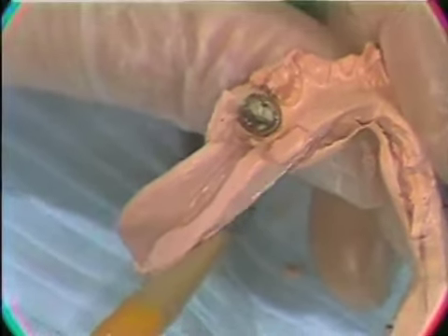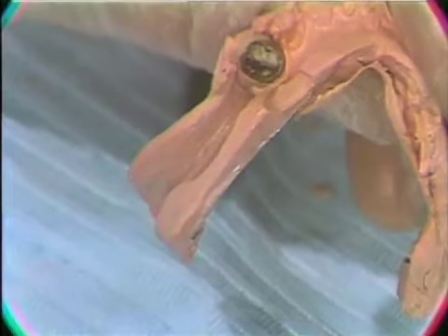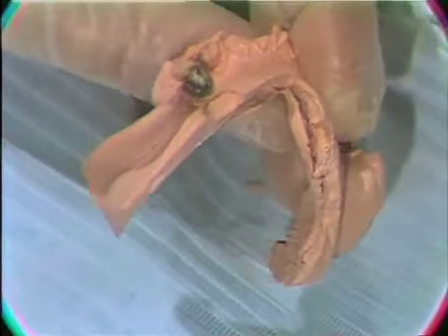So we come over here, this looks good, and here again our tray is a little bit wide, and we'd want to narrow the tray. So we would go back to the lab now and trim the tray back so that the peripheries of the tray will be under the peripheries of the impression.